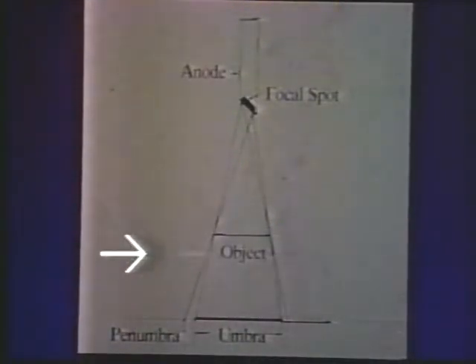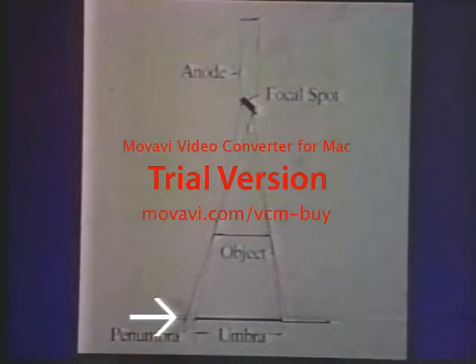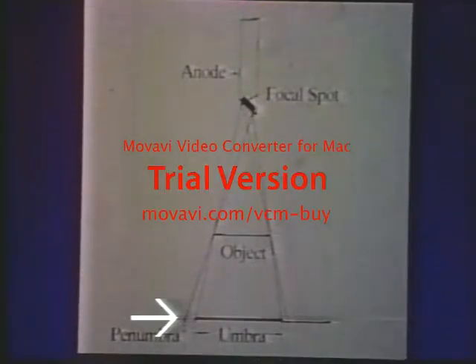If we go back to the focal spot and look at the X-rays that are being produced at the other edge of the focal spot, or the target, you'll notice they follow a different path, passing by the object, but then they will be recorded at a far lateral side of the image on the film. This unsharpness then means that the edge of the object is not represented by a finite line, but is unsharp where we try to identify the edge of a given object.